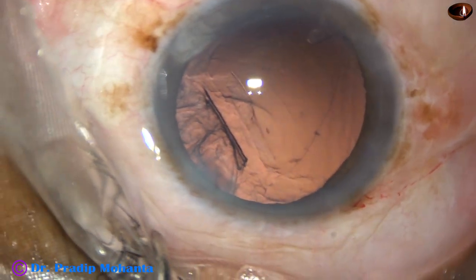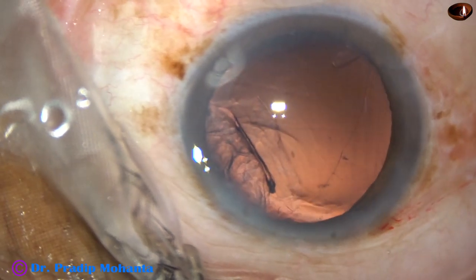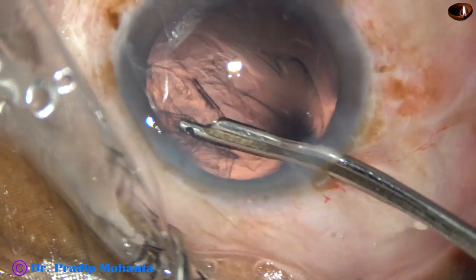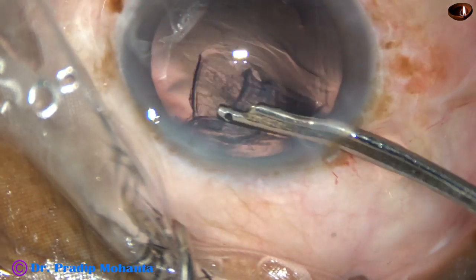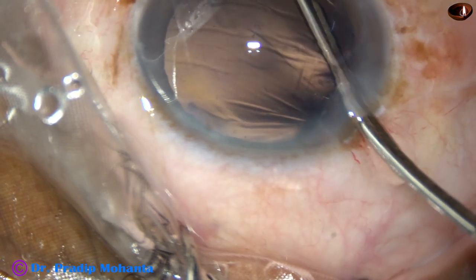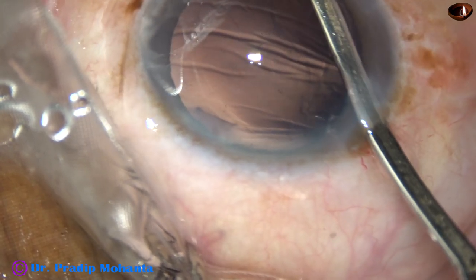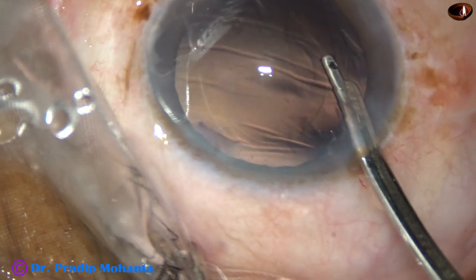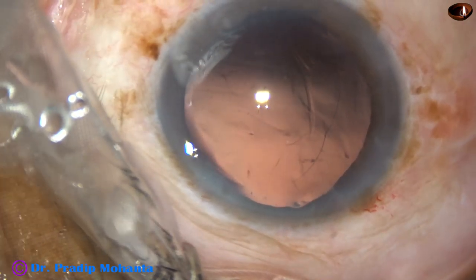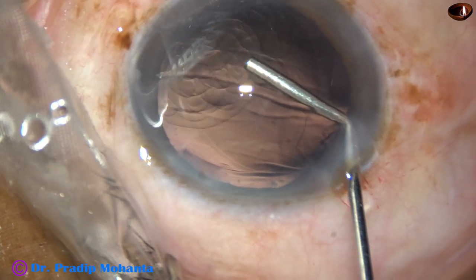The cortex on the left side is to be removed. I use a 23G Simcoe cannula to remove this cortex. Just hold it and don't pull it centrally — sweep at the equator to and fro tangentially, and this will safely remove the cortex. Cortical cleanup is complete. The anterior chamber is formed and viscoelastic is injected to fill up the AC and the capsular bag.